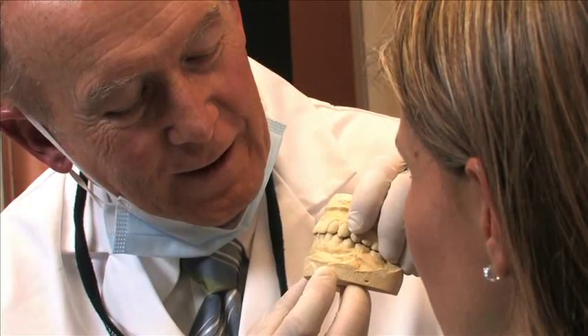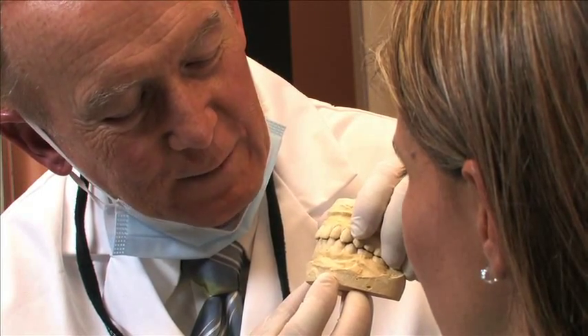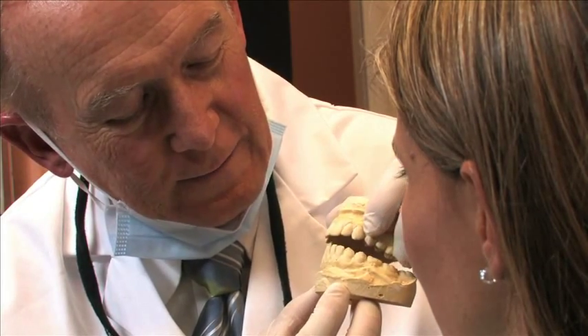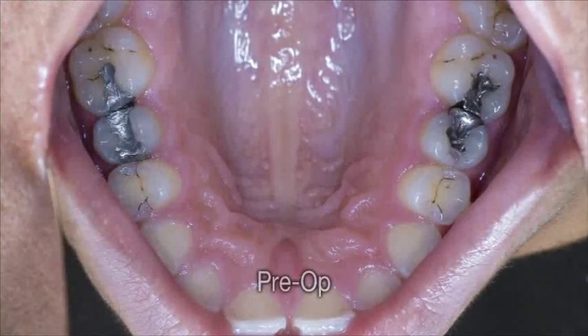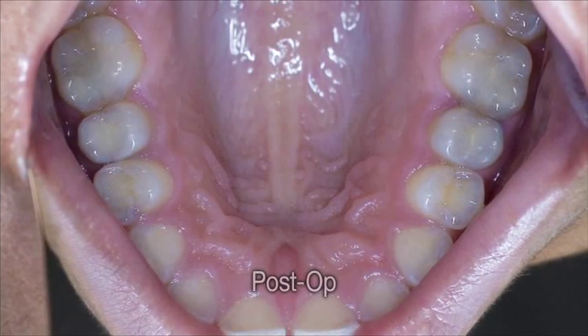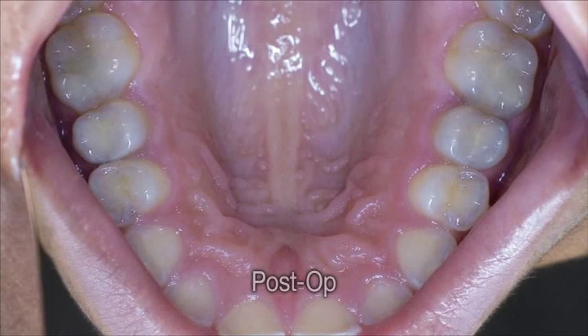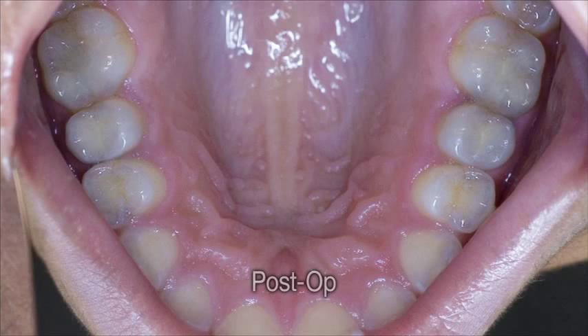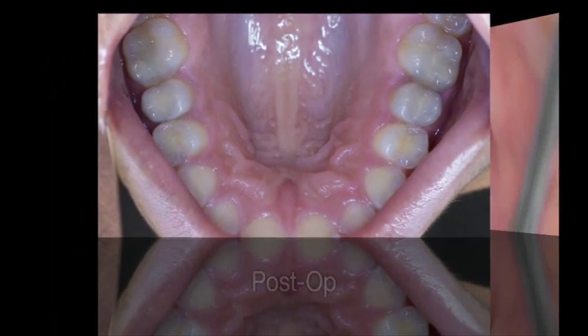When the lab receives the impression from your dentist, they will custom make your filling for your tooth. There are several types of materials they can use for the inlay. The first type of inlay is porcelain or ceramic material, colored to match your tooth. In addition to being aesthetically pleasing, porcelain or ceramic inlays are also quite stain resistant and hard.